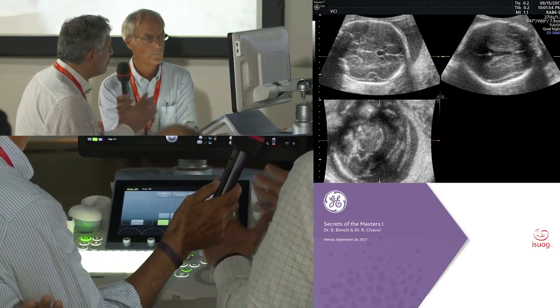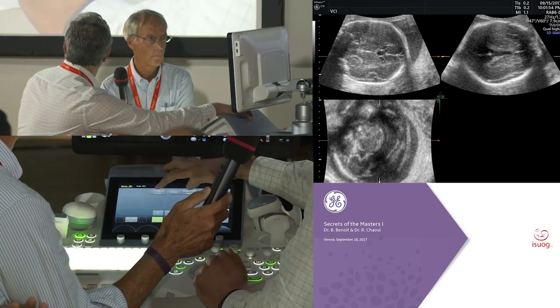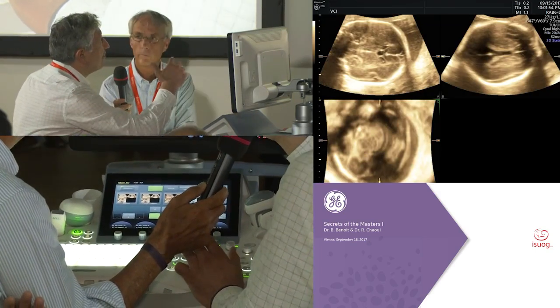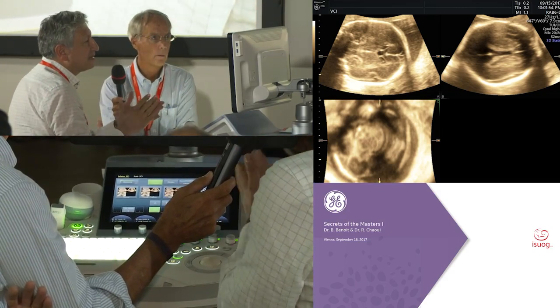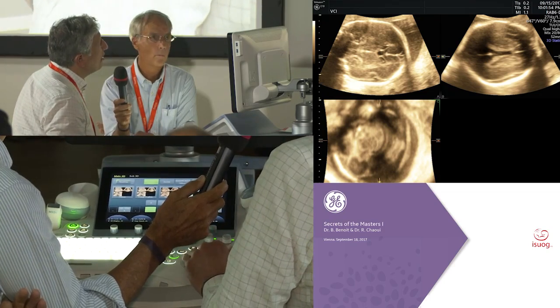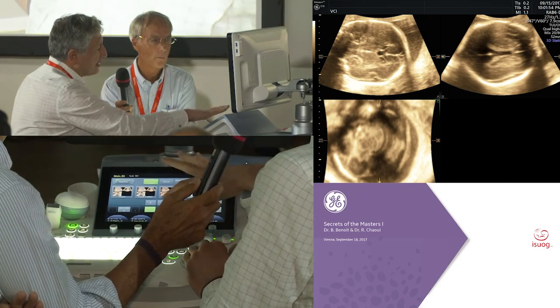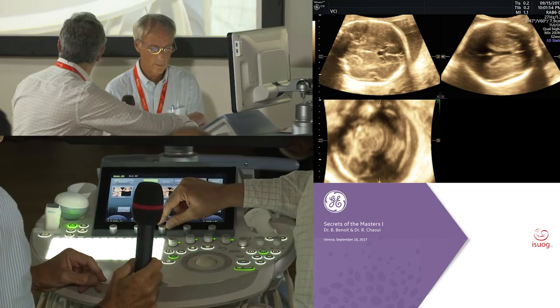So I use, in general, mainly the volume contrast imaging, the VCI. So I add VCI here. I prefer to have this kind of sepia color to know from my images if it's VCI or original plane. And then, as you see here, we see here the thickness. It is written as 2 millimeters, and you can decide to go. Oh, no, this button here.